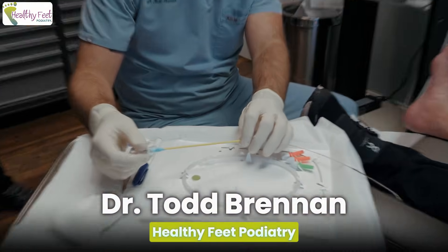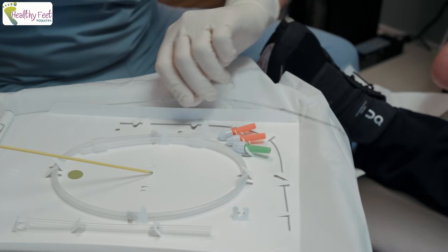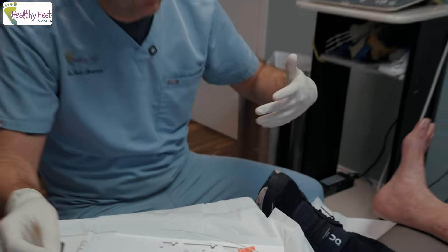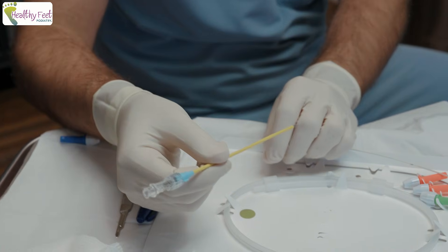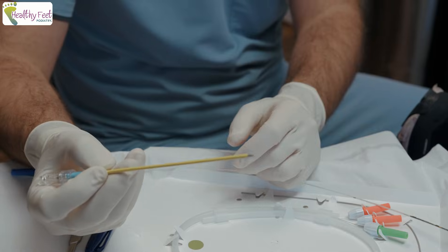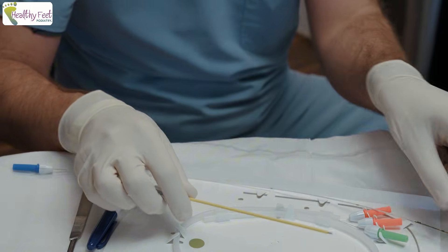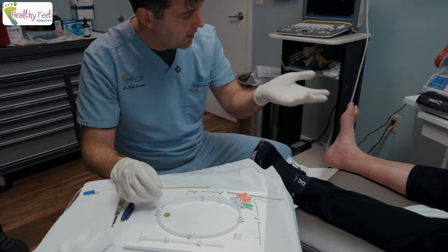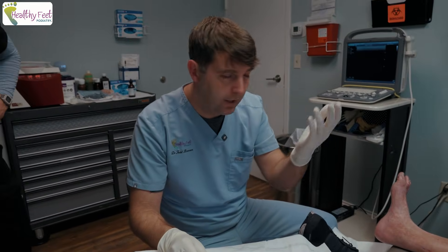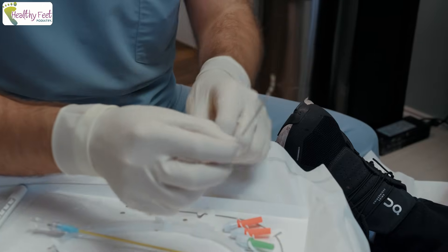We'll name-drop Curonics — with a C — a peripheral nerve stimulator that we're doing for chronic foot pain and neuropathy specifically. We have an introducer here that slides underneath the skin. It's cannulated, so there's a hole, and the lead goes through it to go underneath the skin and basically helps stimulate the nerve to shut off pain signals to help people who have chronic foot pain, ankle pain, or neuropathy pain.